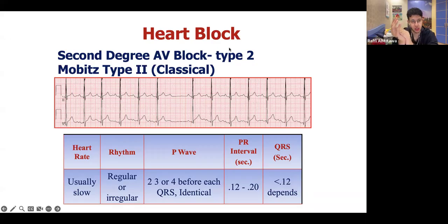With the premature contractions, what happens is you get the PQRST, sometimes the P, but you get the PQRST, and it's abnormal. It represents some sort of abnormality. So you get everything, but it's abnormal looking. With the beat drops, or with the second degree AV blocks, you don't get the QRS, so you don't get the heartbeat. The heartbeat is skipped. In premature contractions, you get the heartbeat, but it's just weird. That's the difference. Maybe I just thought of that, or maybe someone might come up with it, but in case someone asks.